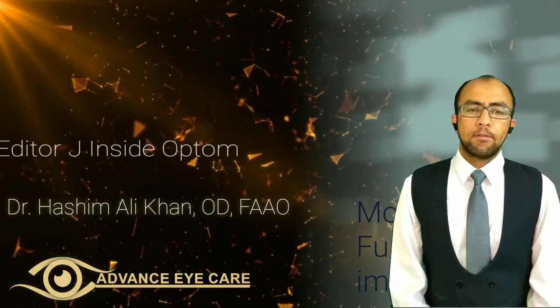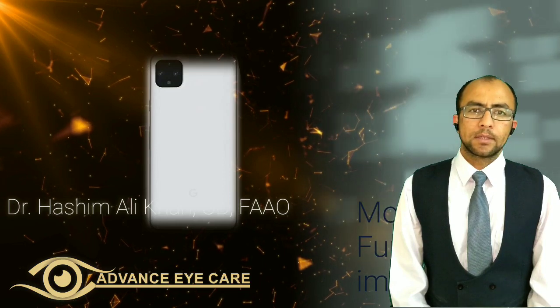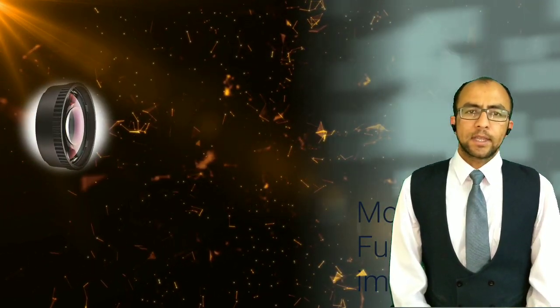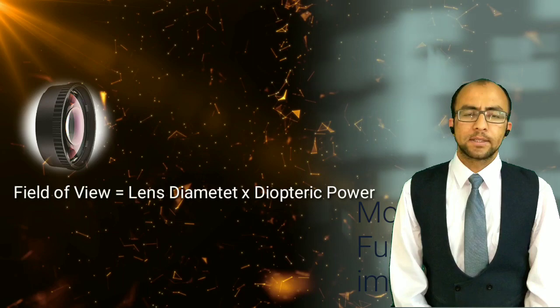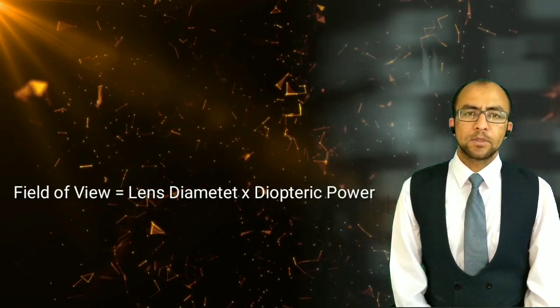All we need is a flash-enabled camera device, a mobile phone, and a condensing lens. The selection of condensing lens is based on the diameter and the optic power of the lens. Usually we recommend a 22 or 30 diopter lens, which comes with the indirect optical lens.